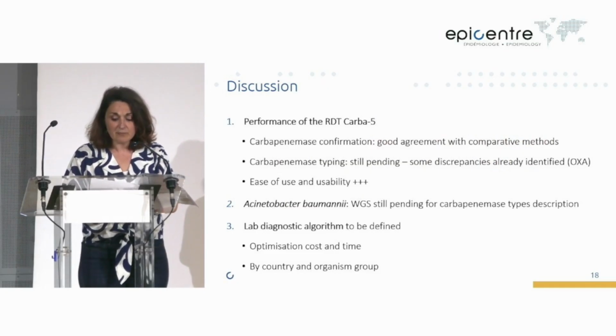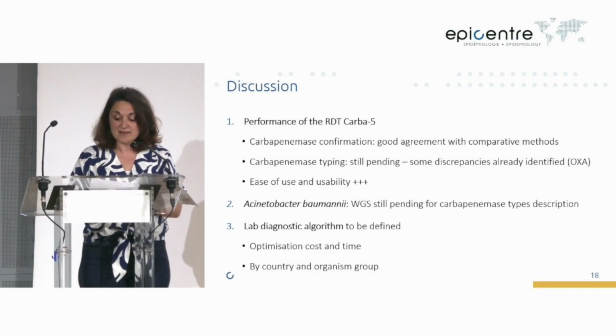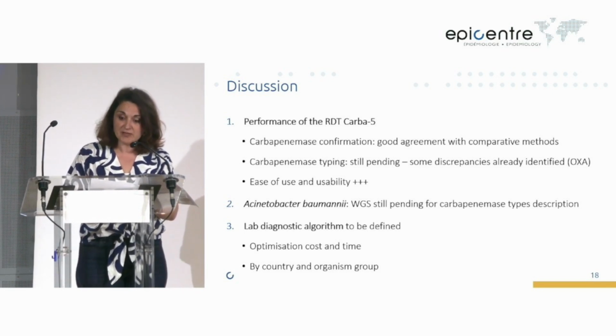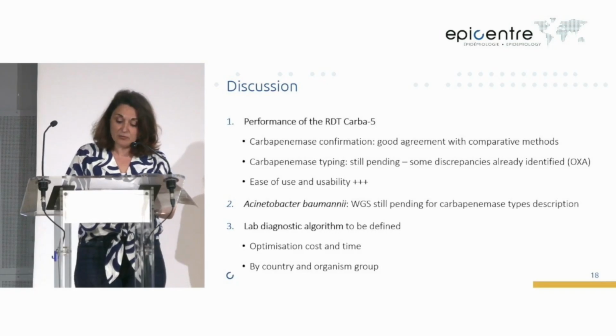There's good agreement with reference methods. However, for carbapenemase confirmation, we're still waiting for carbapenemase typing, but it seems that for the OXA line, there are some discrepancies. Now, the ease of use, as reported by the lab technicians, is compatible with the routine use in MSF labs. We're still expecting the typing of A. baumannii for carbapenemase type description.